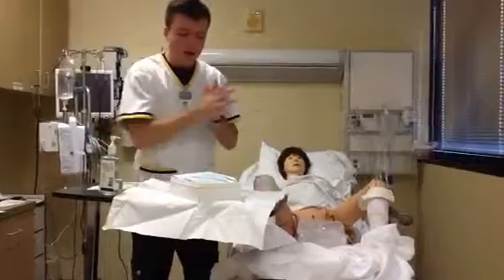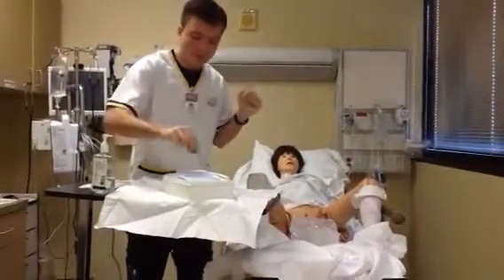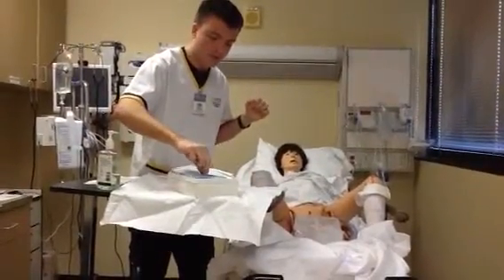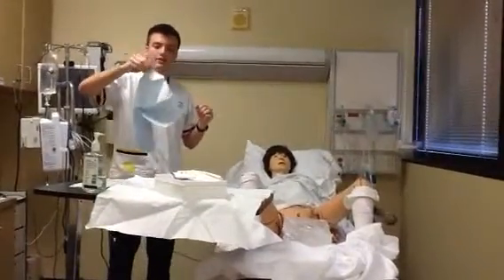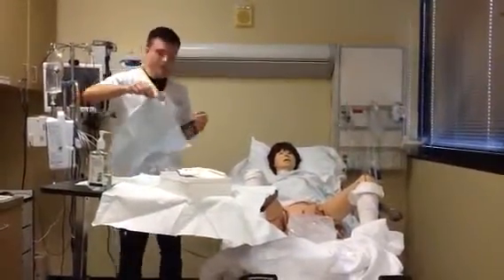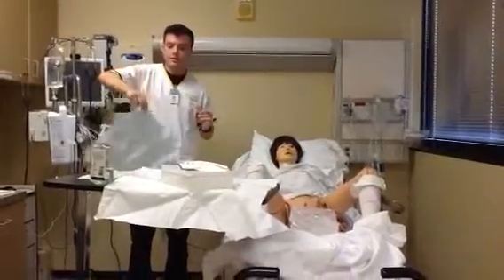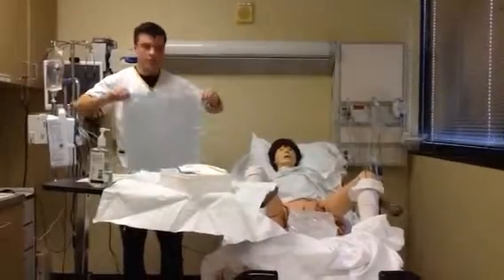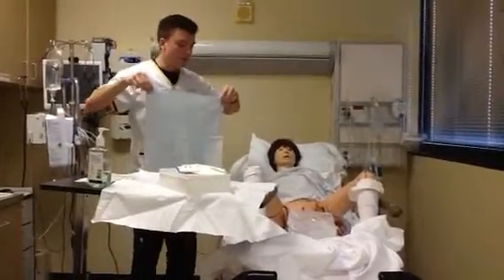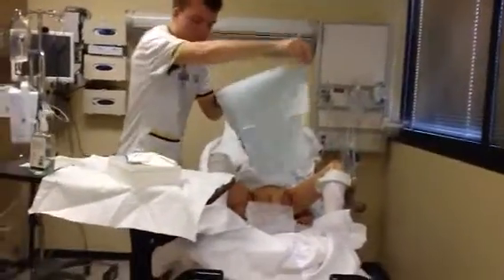Okay, I'm going to apply the drape, so I'm going to pinch over the shiny portion. Again, making sure that I'm only within 1 inch. I'm going to take a step back, keeping the sterile field in front of me at all times. Shake open the drape, and with the shiny waterproof side down, I'm going to drape it in between Mrs. Knight's legs.